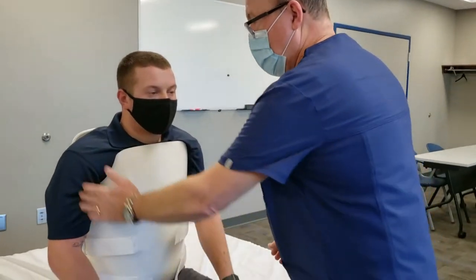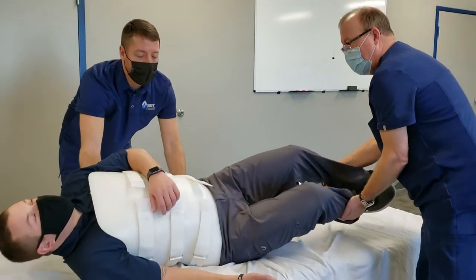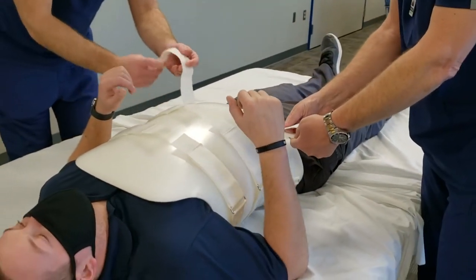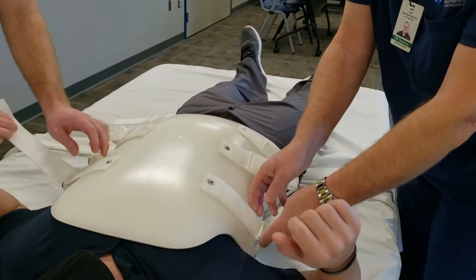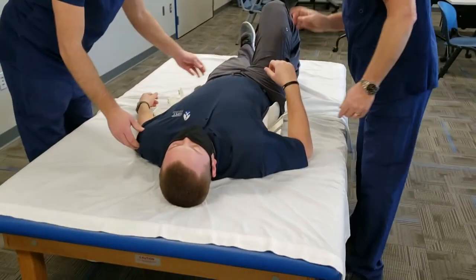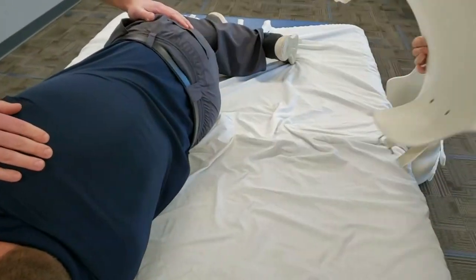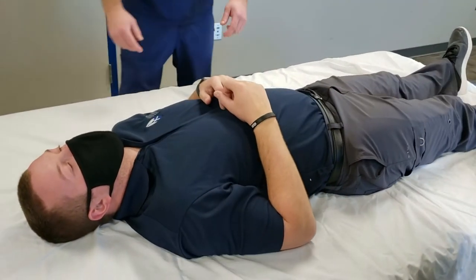To take the brace off, if his injuries require, we're going to have him go down on this shoulder — I would help with his legs — and then have him roll to his back. It doesn't really matter which strap you unstrap first; you're just going to unstrap him and put the Velcro back on itself — otherwise you're going to grab everything you don't want to. The front is then removed. We're going to have him log roll again — lift up this leg and roll to your left — and then the brace is just pulled out from behind. The patient is then log rolled back onto their back and left in that position.